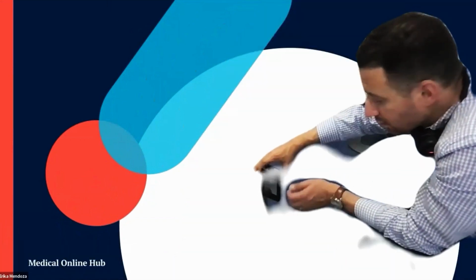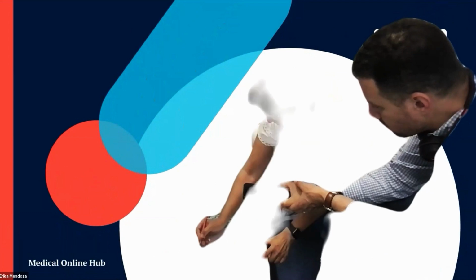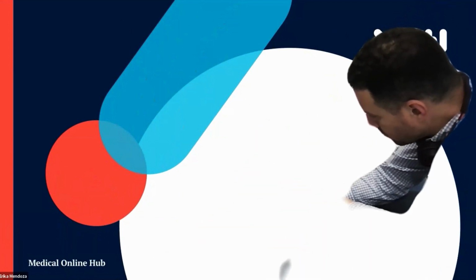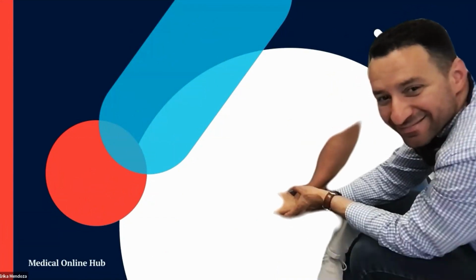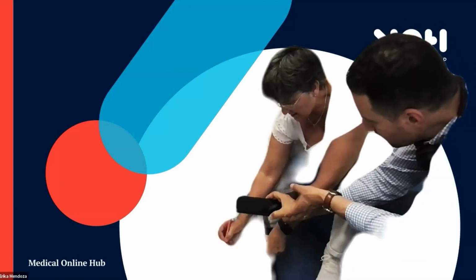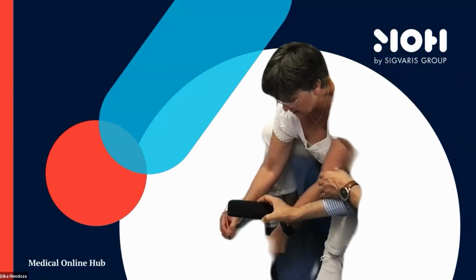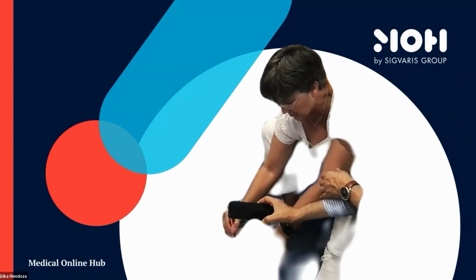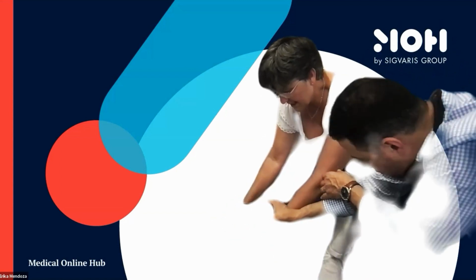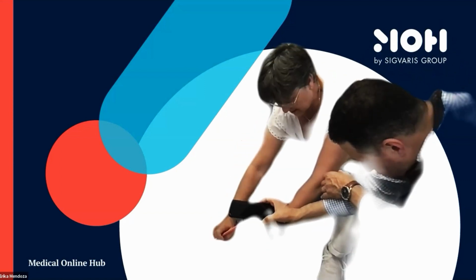I read it again. So we have a deep vein going to the heart. Yes, the heart, for anybody doing physiology. Then we have the junction, the saphenofemoral junction with the great saphenous vein. The blood flow in this vein is orthograde, antegrade. The blood flow in the junction, antegrade. We have a tributary, which is refluxing. And we have to know where this reflux comes from, where the GSV is competent here.